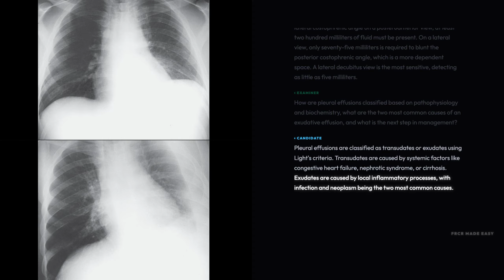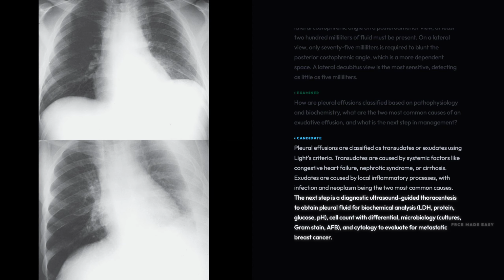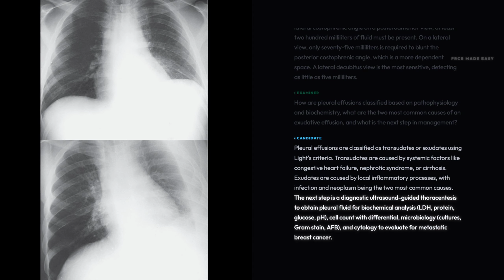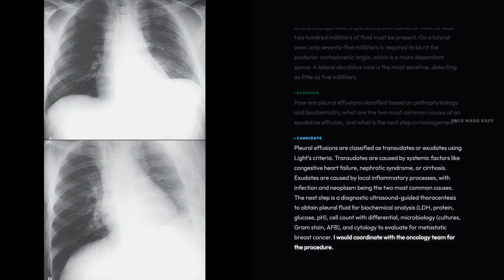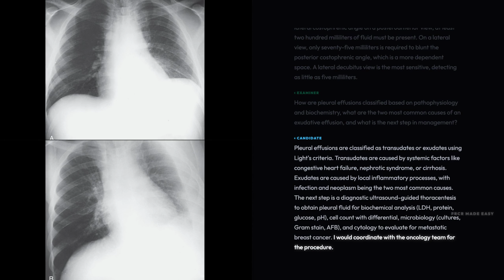The next step is a diagnostic ultrasound-guided thoracentesis to obtain pleural fluid for biochemical analysis, cell count with differential, microbiology, and cytology to evaluate for metastatic breast cancer. I would coordinate with the oncology team for the procedure.